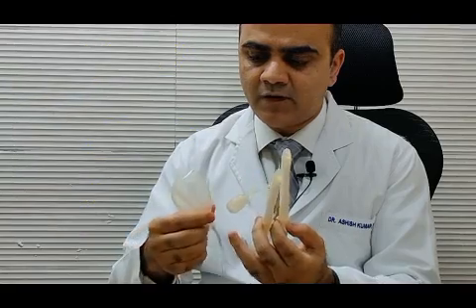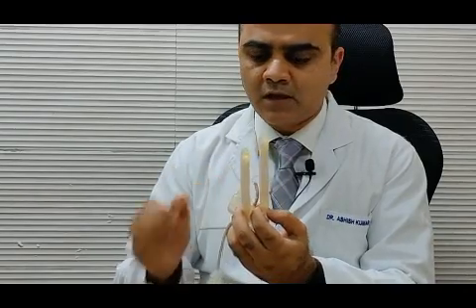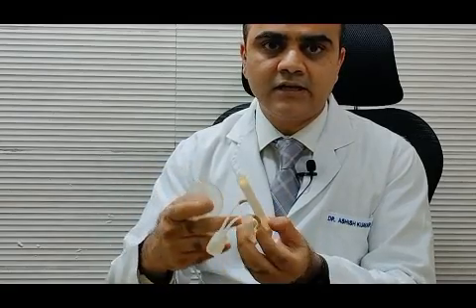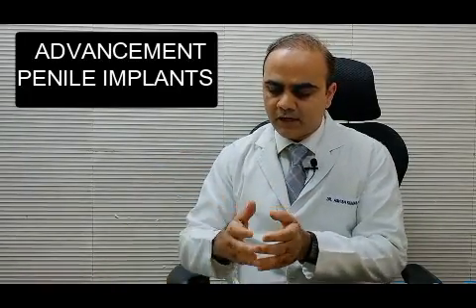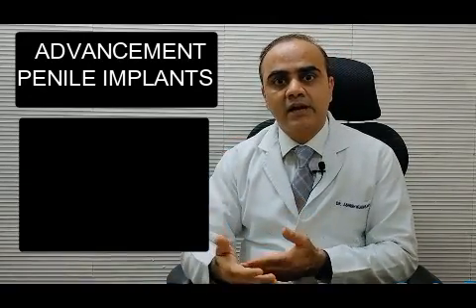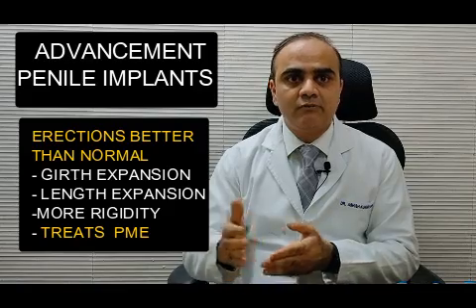So in this case, what happens is that the reservoir has the fluid which is normal saline, and once you want an erection, you press this button. The fluid from the reservoir comes into these cylinders, and you have a rigid erection. And once you are done, you again press it, and the fluid goes back into the reservoir. So basically, these are an implant where there is an extra reservoir, but because of an extra reservoir, it gives you a better erection, a more rigid erection, and a more complete erection. And you can also go for a size expansion and a girth expansion with a 3-piece implant.